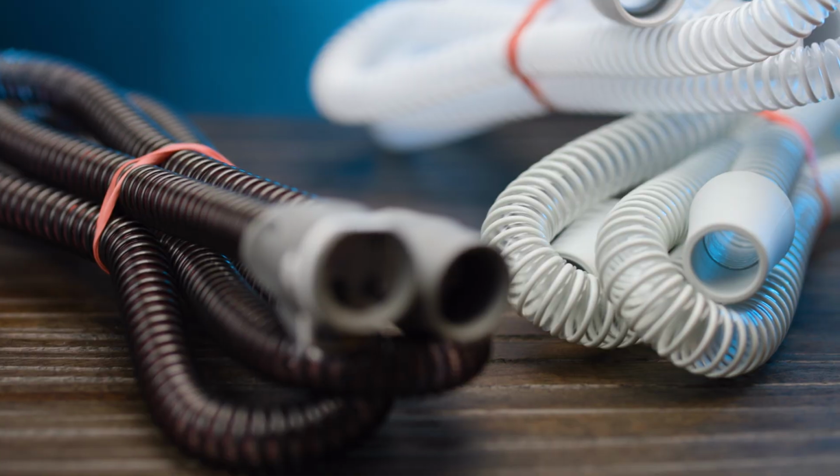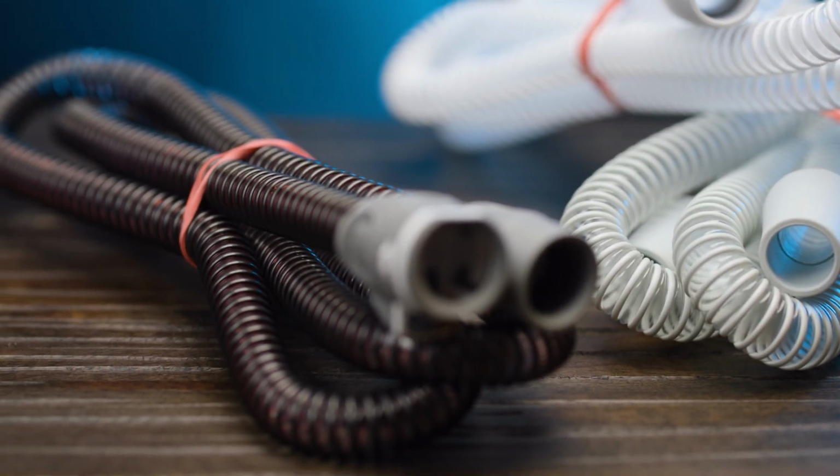It has a coil that runs the length of the tube, and that then plugs into the unit. When in use, electricity passes through this coil, heating the air inside the tube to keep the temperature consistent from unit to mask to avoid condensation buildup. Heated tubing is useful for anyone that uses a heated humidifier, but it is especially important for those that live in colder climates, which are more prone to causing condensation.